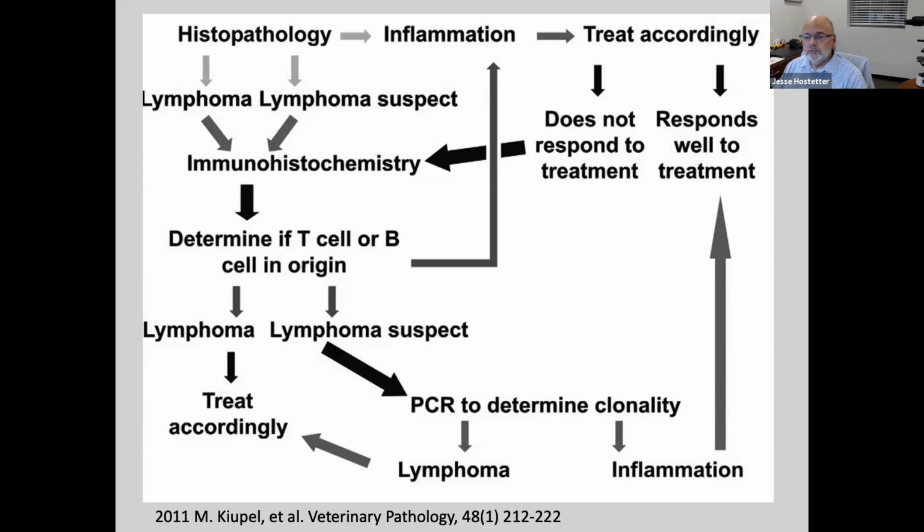A question: when I see mucosa that's lifted off the lamina propria, I think this is in relation to the slides I showed where it had torn off and it looked for all the world like a dilated lacteal. Does that suggest to you that there is intestinal injury because that mucosa doesn't normally lift off? If I do suspect that, and that's a really good question and definitely a possibility, I would look for evidence that that epithelium is injured. I would go and look for the changes that we talked about earlier.